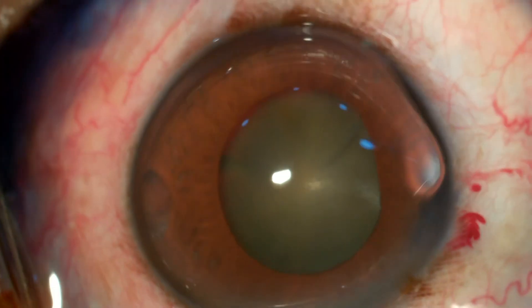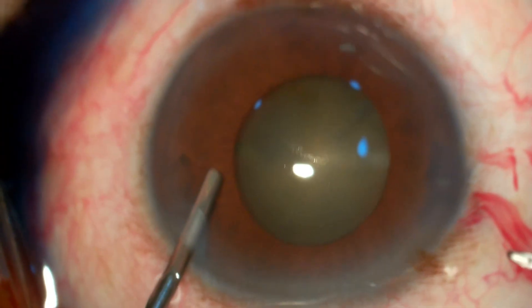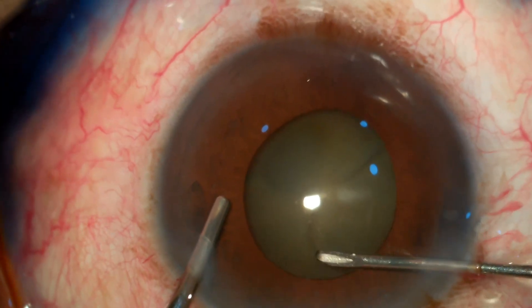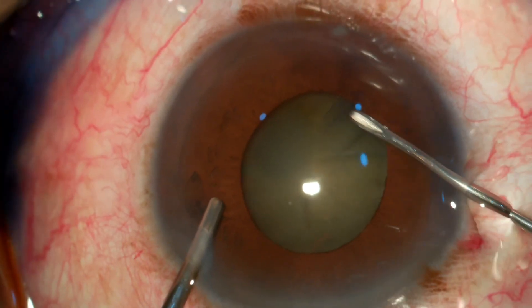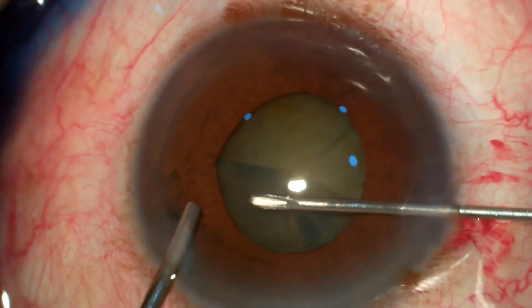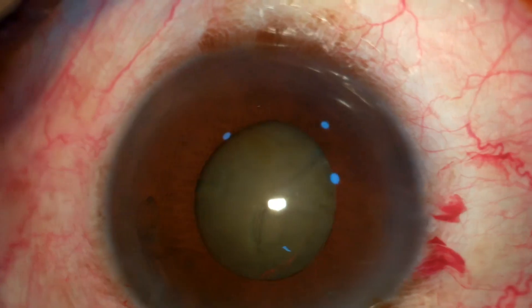After staining, I enter the capsule and put dispersive viscoelastic into the anterior chamber, then doing capsulorrhexis with a 26-gauge needle. My target capsulorrhexis size in these patients is around 5 to 5.25 millimeters, and after achieving the desired size I'm done.